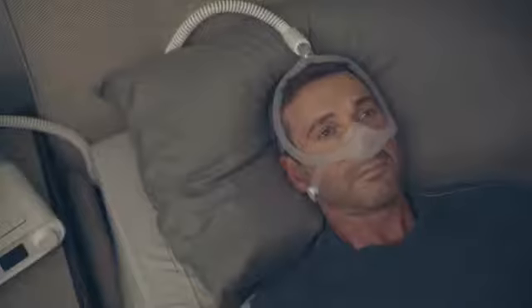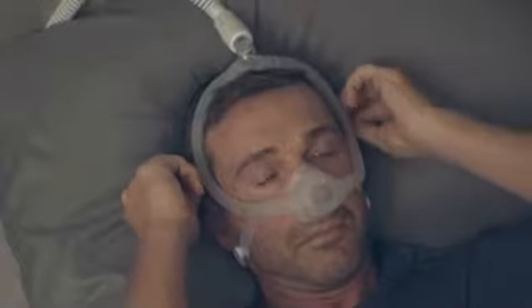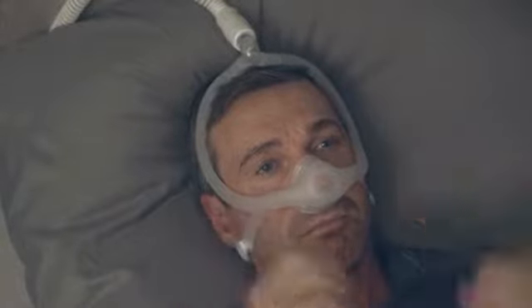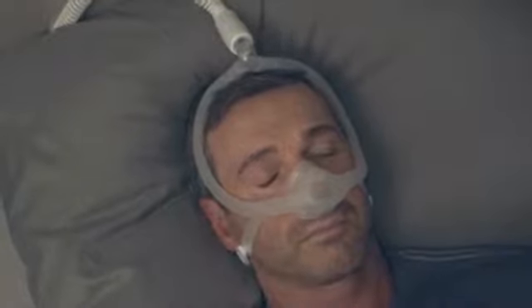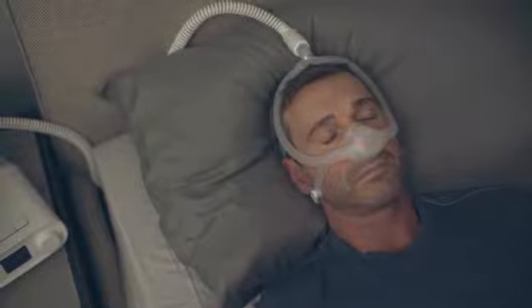To correct a leak, try reseating the mask by pulling it directly away from your face and then gently setting it back into place. You may need to adjust the top and bottom straps, but avoid over-tightening the headgear. If too much air is escaping, ask your healthcare provider to help you find a cushion and frame size that is a better fit.